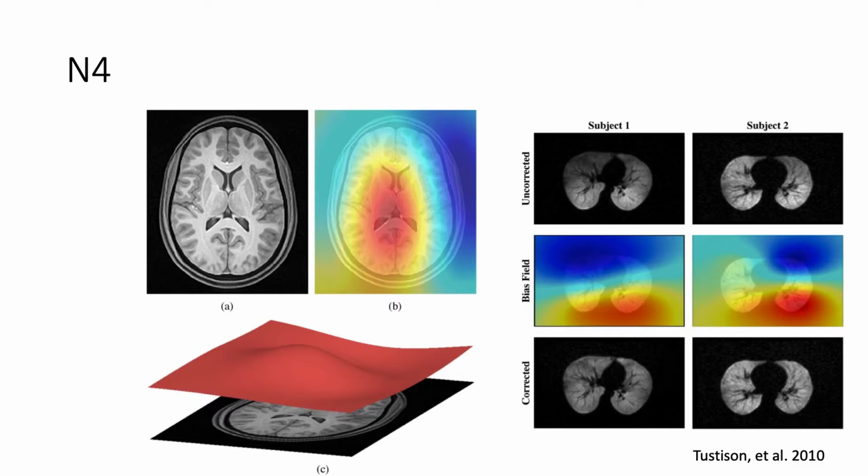What does that mean? I don't know if it's going to be covered, the difference between rigid and affine, but basically the old way of doing it is you find certain landmarks in the brain and you take somebody else's brain and try to find those same landmarks and fit it in there and squish the brain in three directions, like the XYZ.